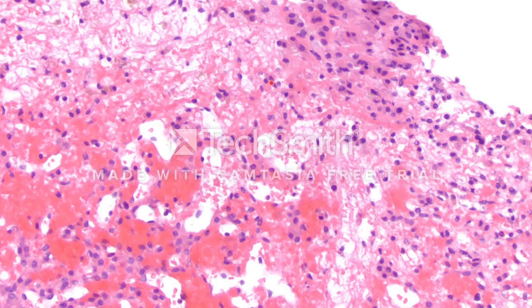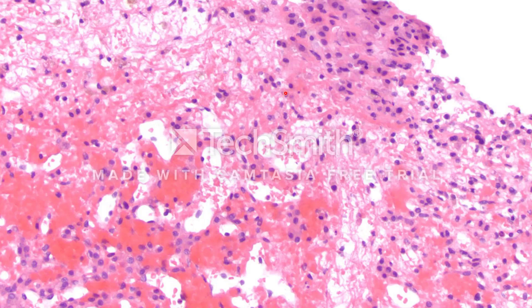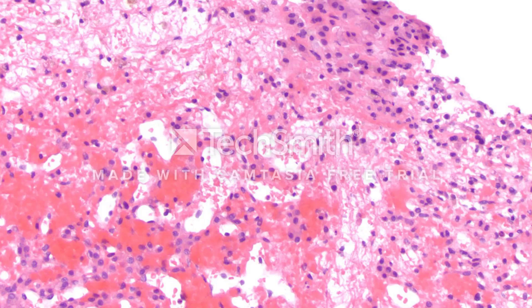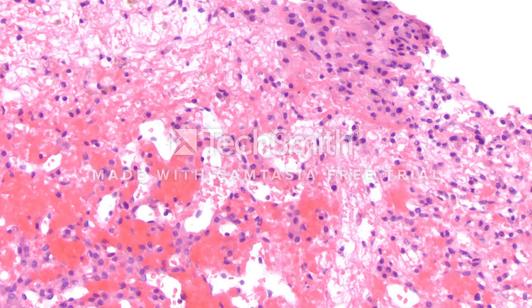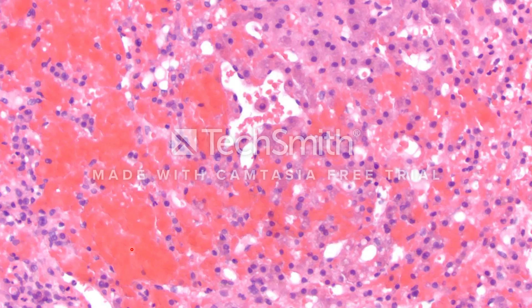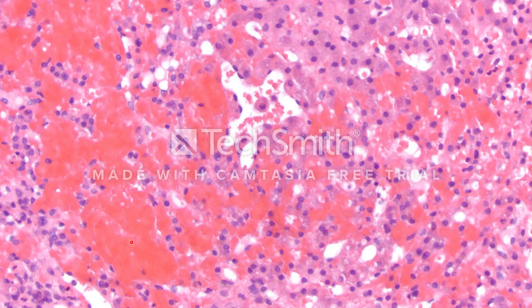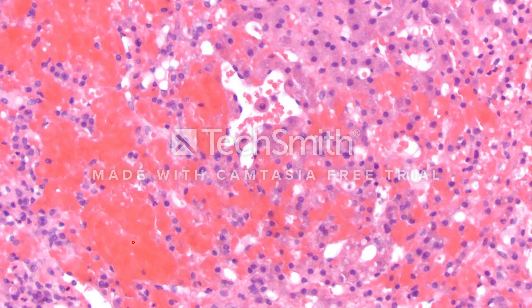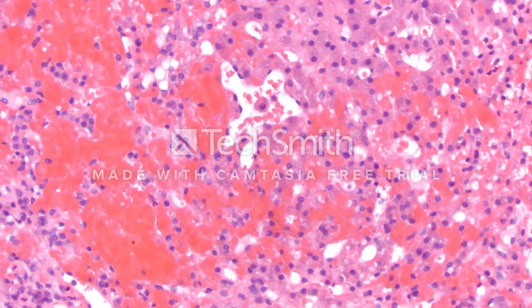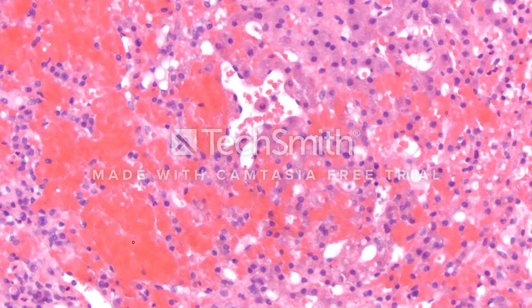I would go further and say there is collapse, and this becomes relevant when we start reviewing the trichrome stain. Here's another look where you see blood in the sinusoid, so there's congestion of the sinusoids. In fact, there's dilatation and peliosis around the zone 3 region.